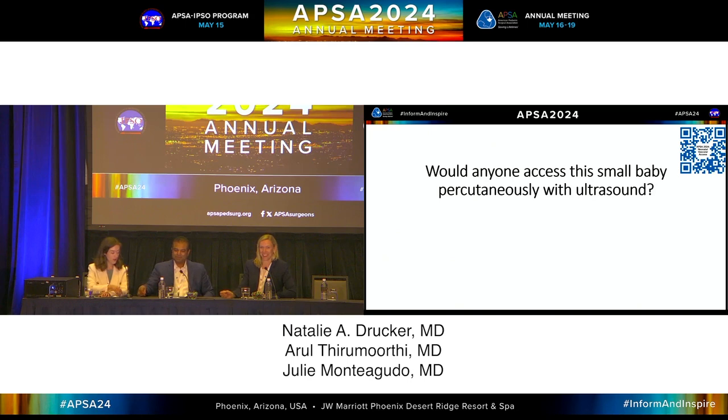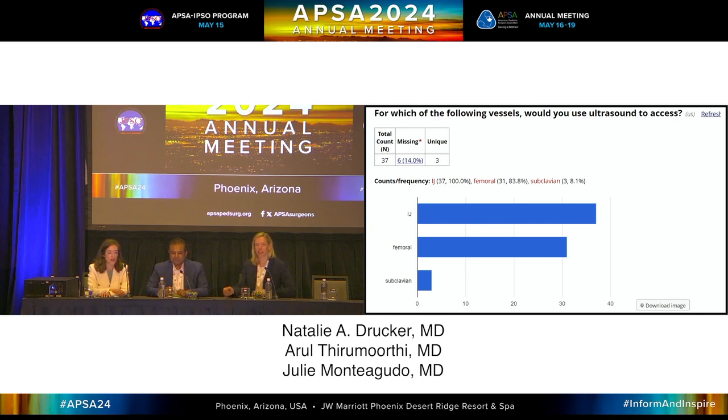Yeah. So raise your hand at this point if you would think about using an ultrasound to put in a line in a 500-gram baby. Anybody? Okay. Our next slide, I think we have some of the survey results. Which of the following vessels would you use ultrasound to access? And clearly the IJ would be the preferred location.